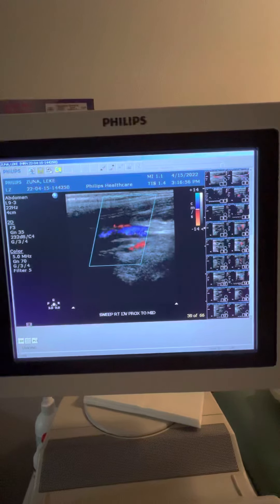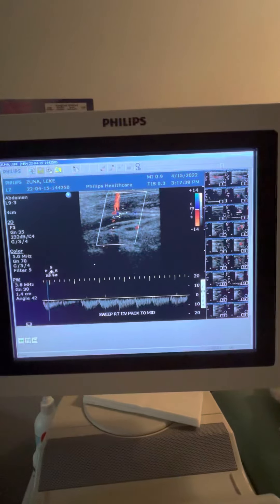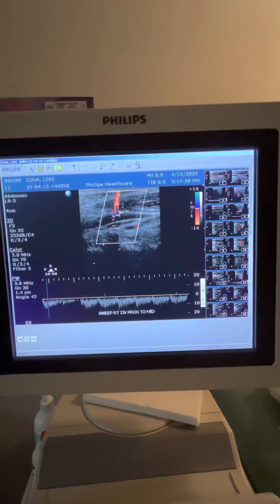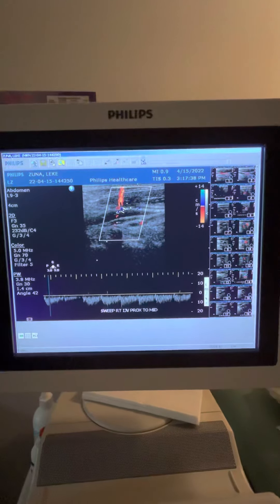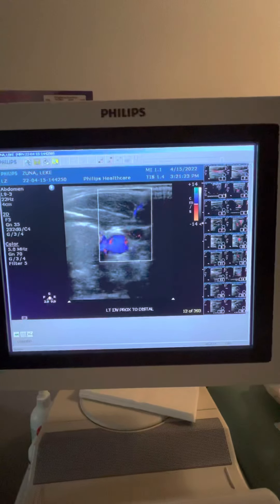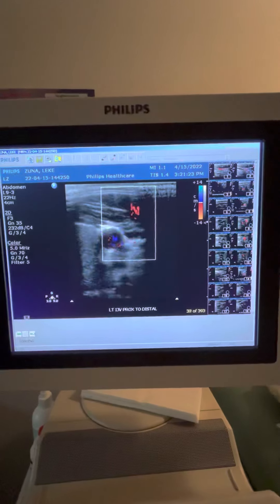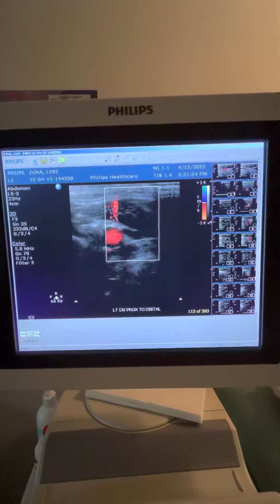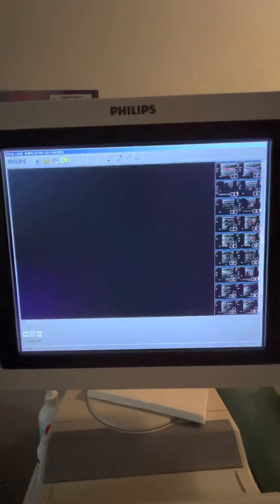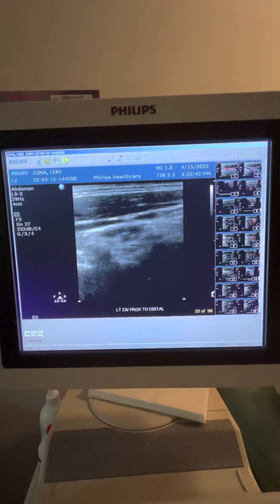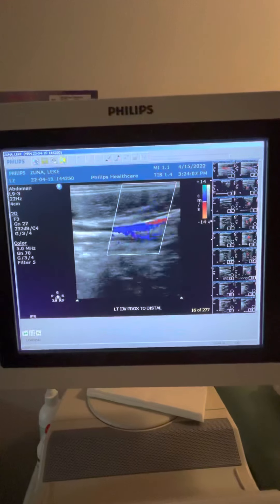Right side. Vein flow, distal. Left side, internal jugular vein.